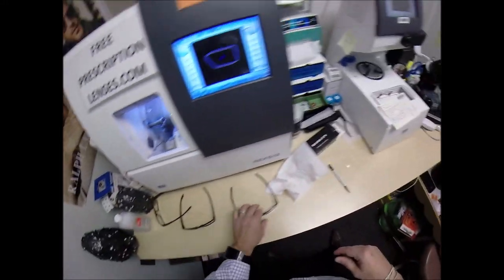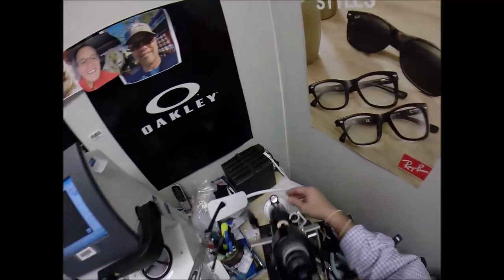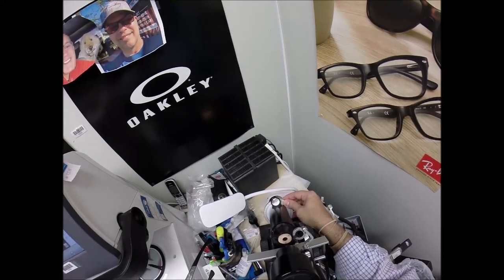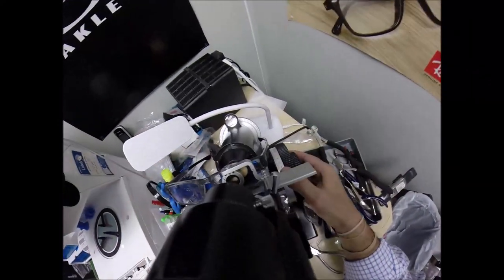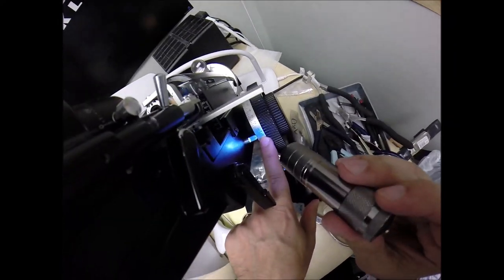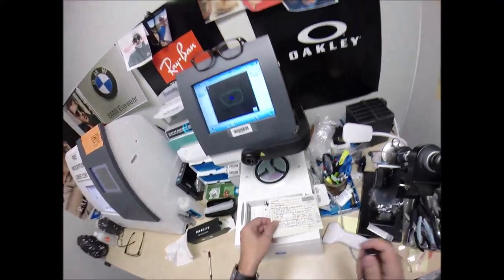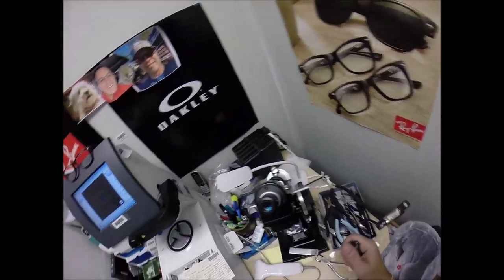Add to my sticker collection, come down here to the lensometer, spin the axis wheel to 75. Exactly halfway between 70 and 80. Put it in, read the power, and I am getting zero Plano. It's not just a city in Texas. P-L-A-N-O, I abbreviated it. Stands for no power.